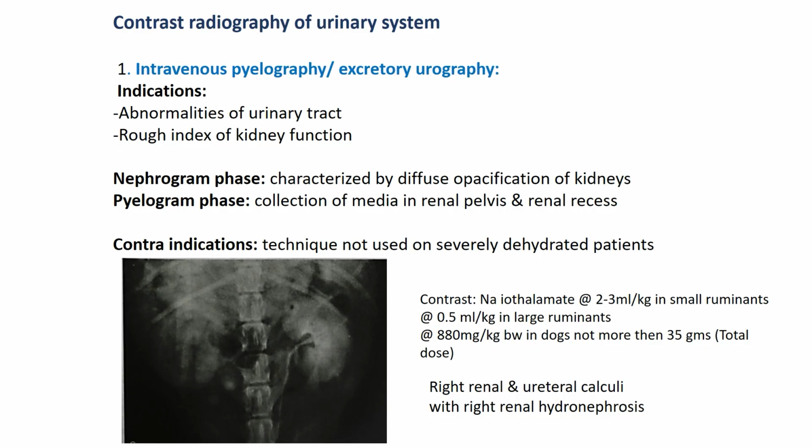This contrast radiography is classified into two phases depending upon the contrast agent. The first is the nephrogram phase, which is characterized by the diffuse opacification of the kidney, while the pyelogram phase is when the contrast agent reaches the renal pelvis and renal recess.